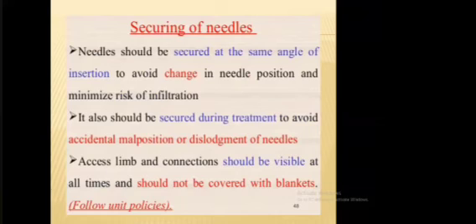The other point is securing of the needle. The needle should be secured at the same angle of insertion to avoid change in the needle position and minimize the risk of infiltration. It also should be secured during treatment to avoid accidental malposition and dislodgement of the needle. The access limb and connection should be visible at all times and should not be covered with a blanket.